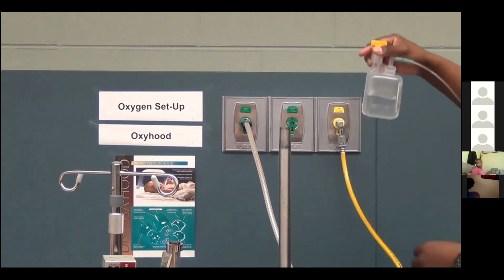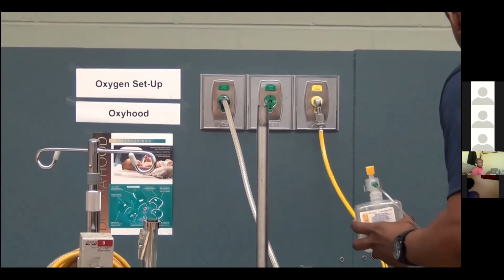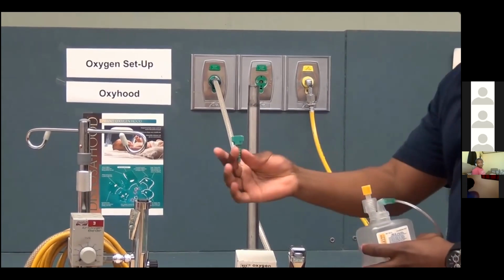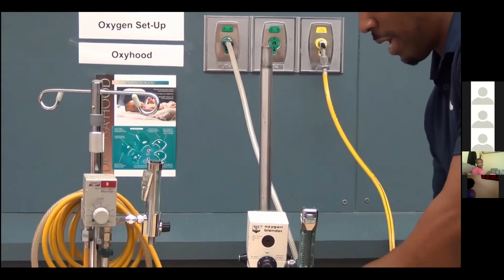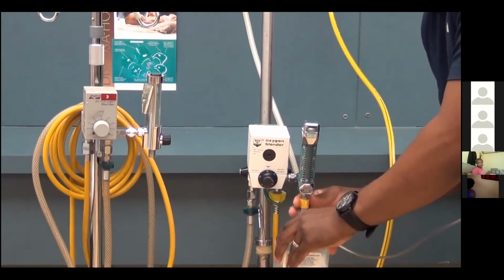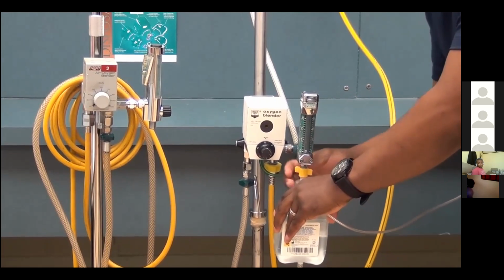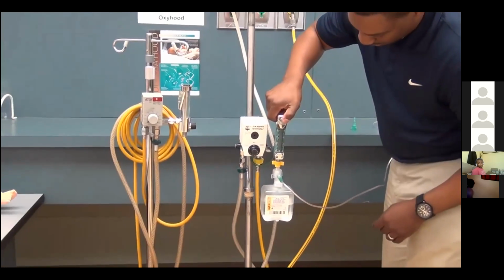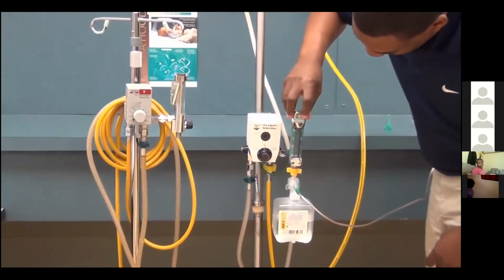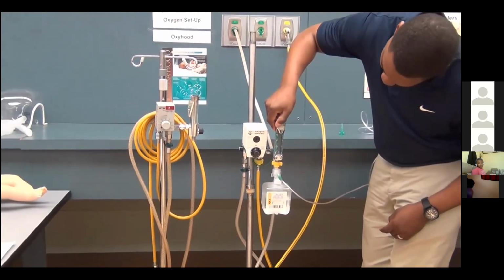In order to use your blender, you can still attach a water bottle if necessary, or your Christmas tree attachment if necessary. And you would just connect it to the flow meter like so. So we will say that our patient is on a 2-liter nasal cannula. We adjust our flow meter appropriately. There we go.